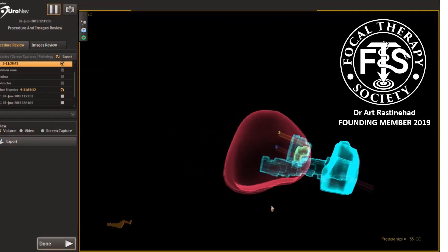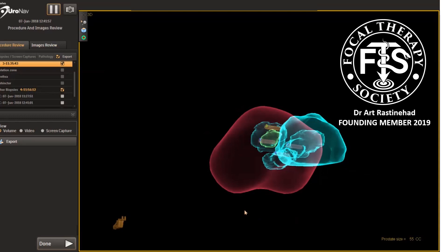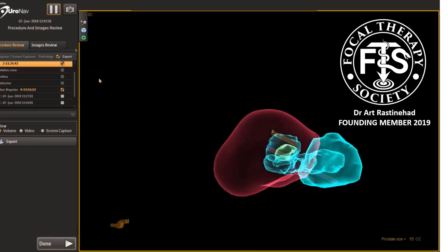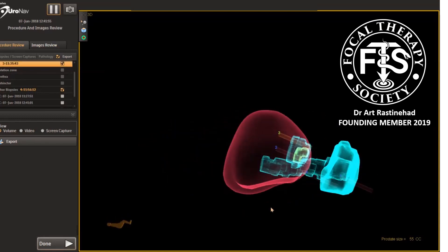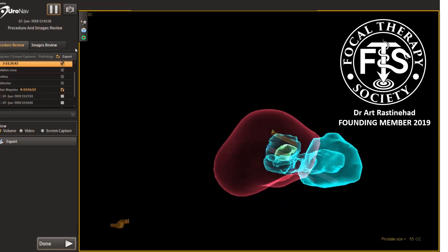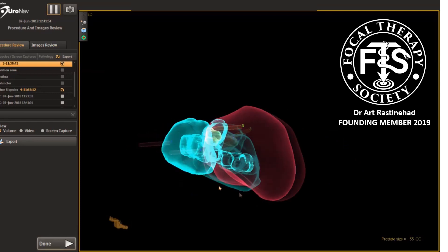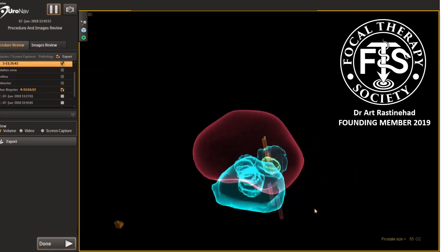After the case is complete, we're able to review the 3D data from the procedure. We're able to take this information and push it back to our diagnostic platform to store it, and be able to review that later when we repeat a biopsy to confirm the tissue has actually been ablated.